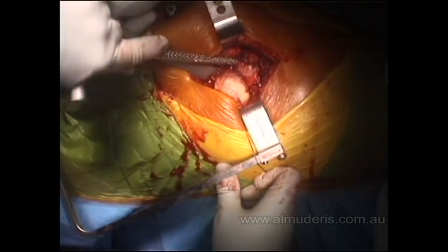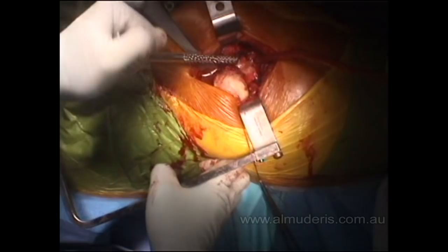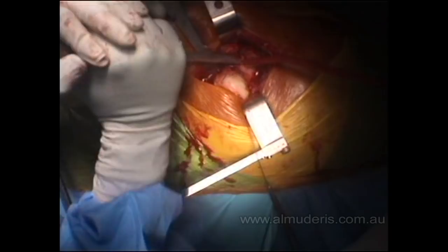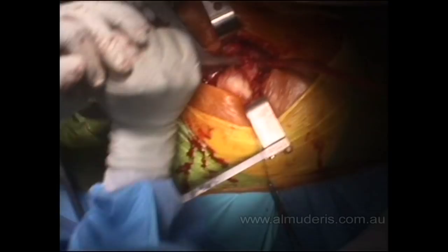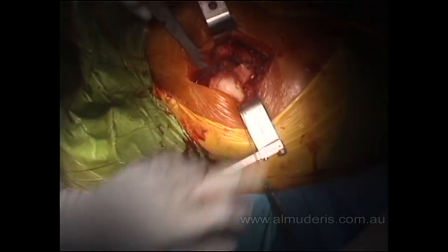Using a canal finder — a sharp instrument — to locate the center of the femoral shaft, then use a curved rasp to follow this. Before cutting, this is a very good method of finding the center of the femoral canal and preventing unintentional varus positioning of the prosthesis, because the femoral neck is still intact.